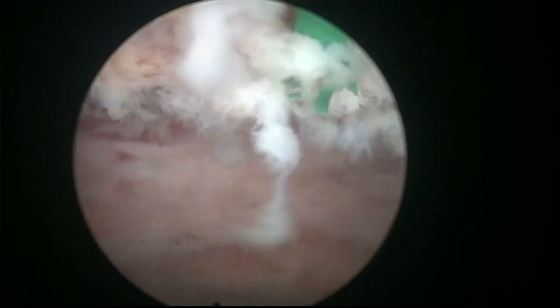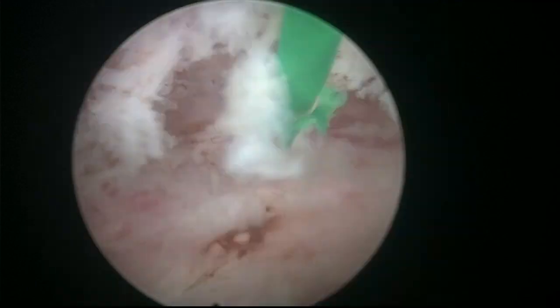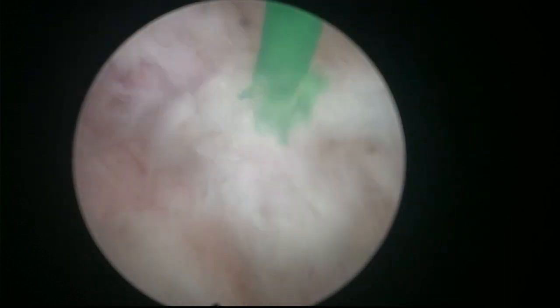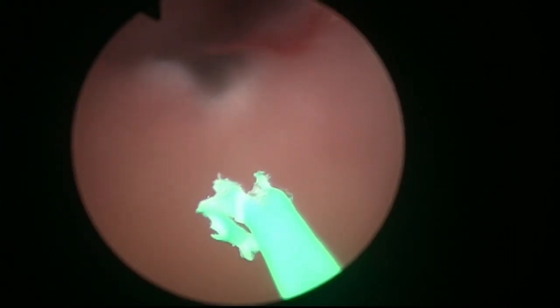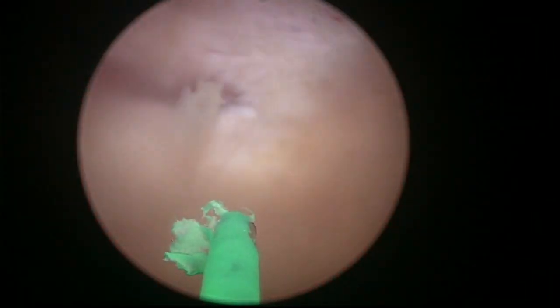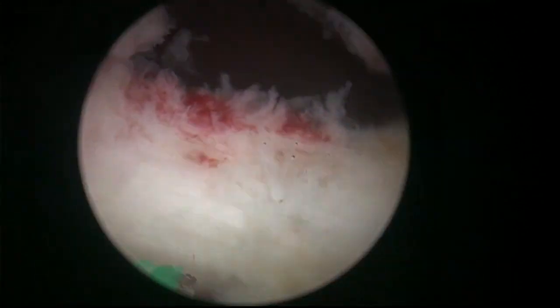And let's see if we can establish a good hemostasis to proceed to morcellation. There we are. Now I think we have an overall much better vision. Sphincter is good. Now, there's still some bleeding.